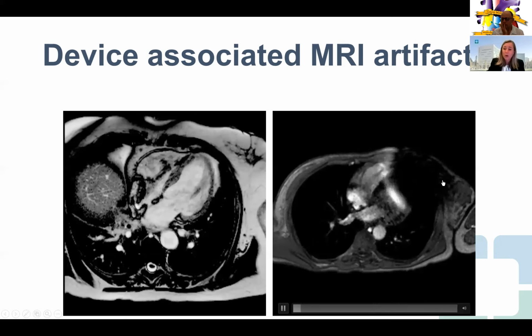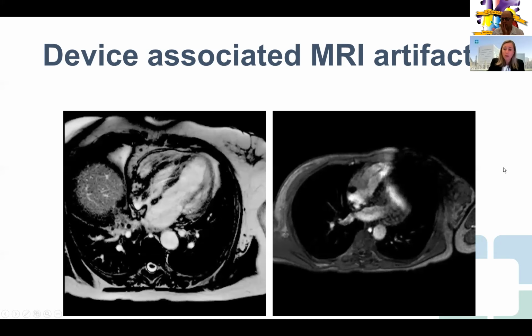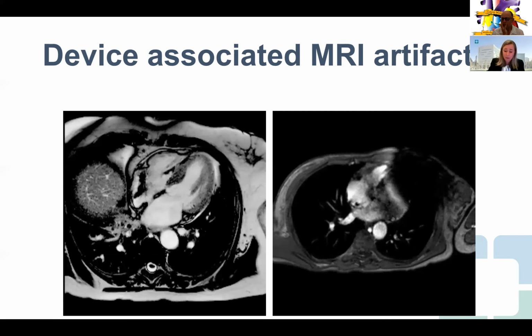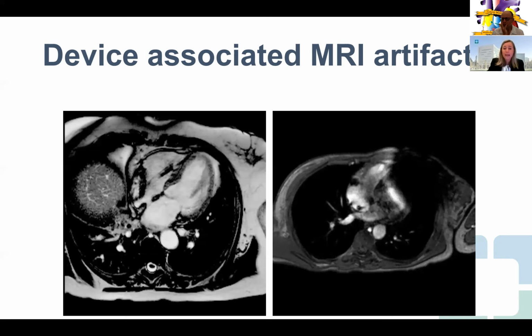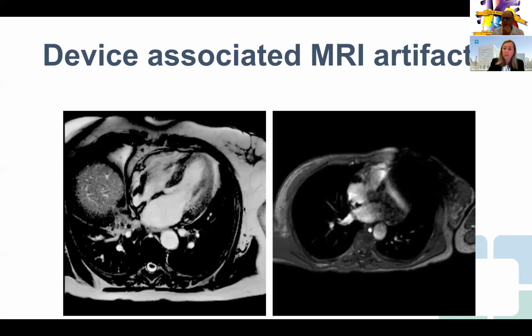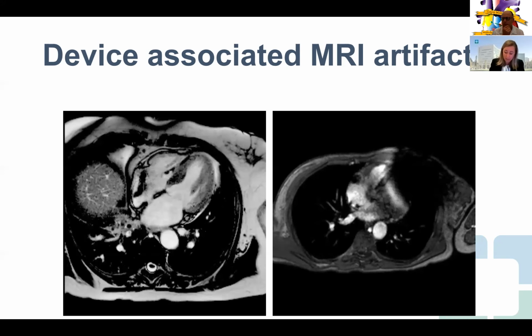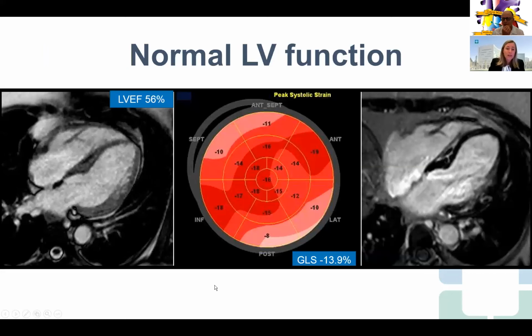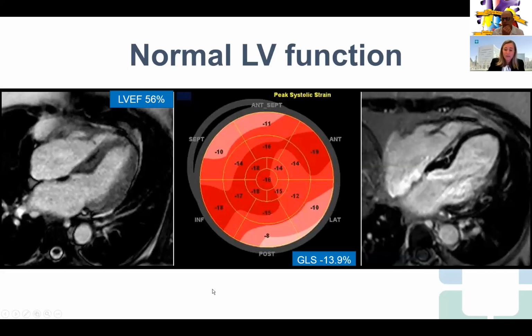So I think always reach out to your imaging expert at your institution to have these discussions, give them a heads up about the patient having a pacemaker, and see what they can do to optimize their sequences to make sure that they get you the best diagnostic quality images. So I've got a couple of examples for you now, and I hope that you'll find these of interest.